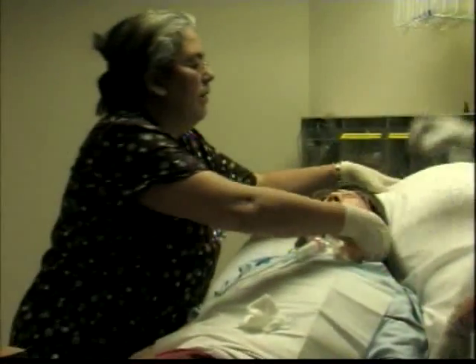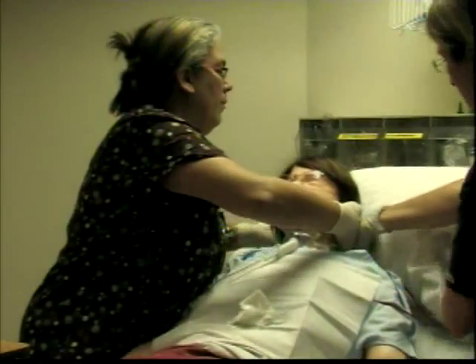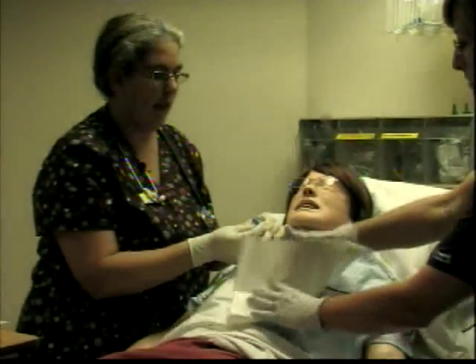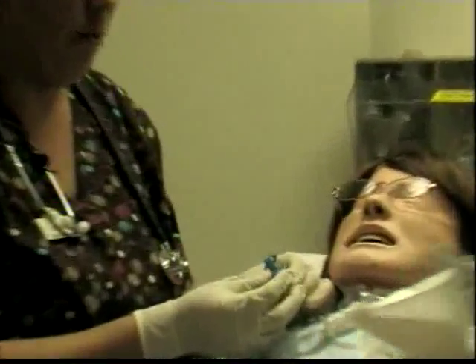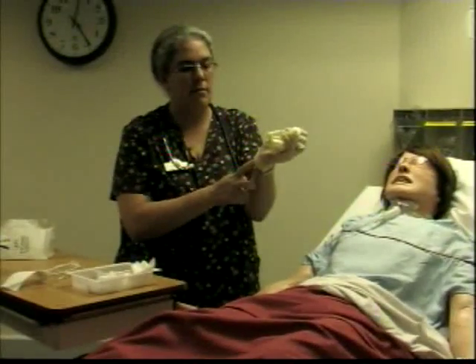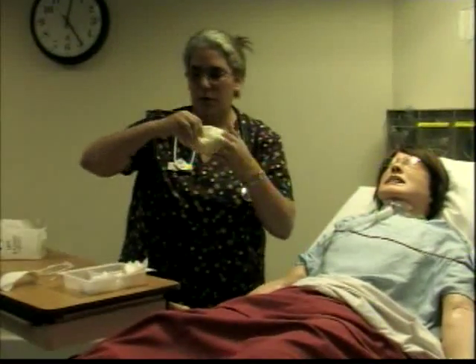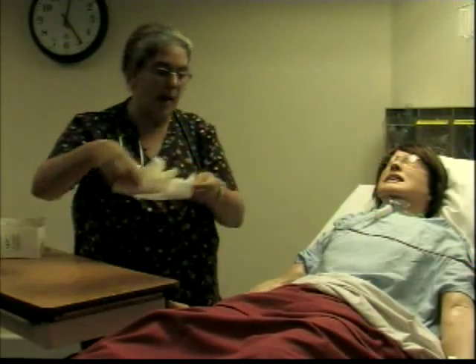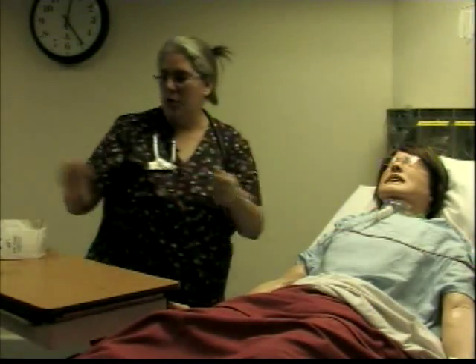Replace the pillow. Check the balloon on the trach. It should be bouncy. Okay. You remove your gloves and you remove it this way. You make sure you have all your trash together so you can put it into your red bag. And then you wash your hands.